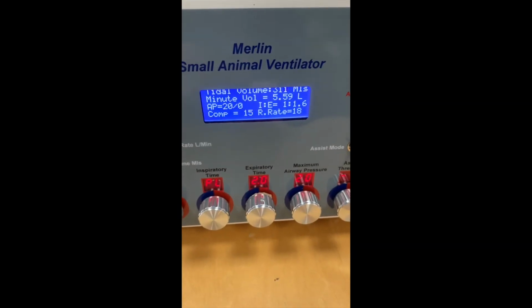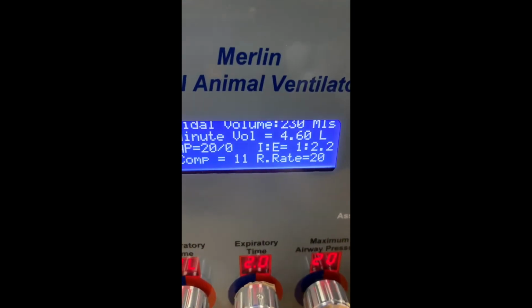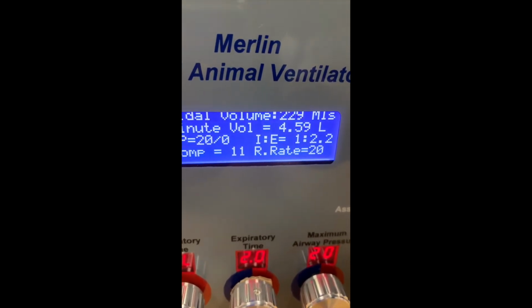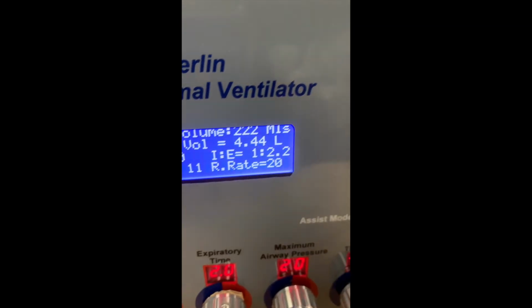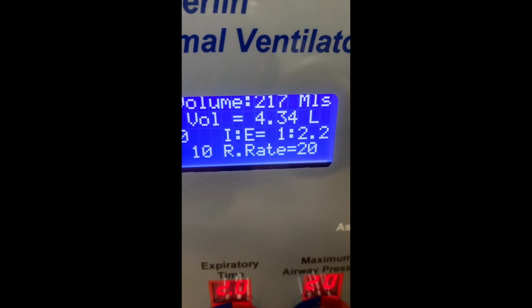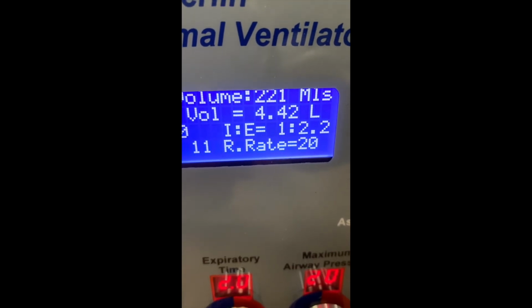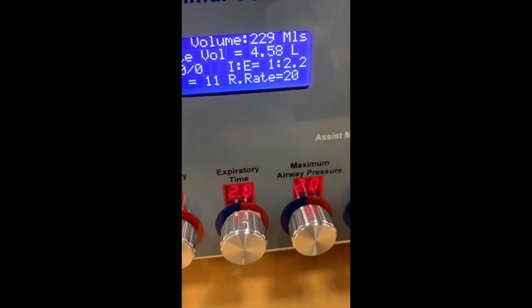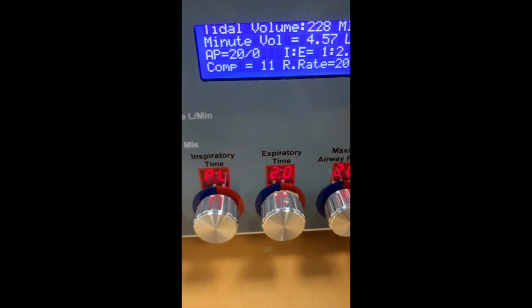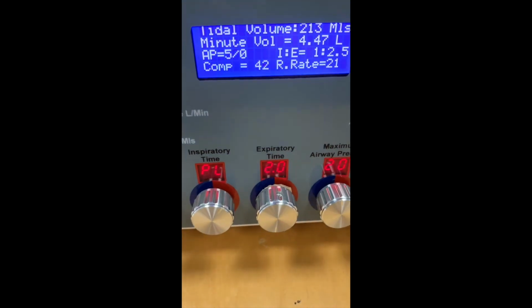So in this instance, what happens if we restrict the patient's chest? So we'll do what we did before, restrict the patient's chest. Because we're pressure cycling, the airway pressure still doesn't go above 20 as our target pressure, but of course the delivered volume is now reduced because the pressure is reached much sooner. So now we're only delivering a tidal volume of 213 mils. As a consequence, our minute volume is reduced and our inspiratory expiratory ratio has gone to 1 to 2.2. And our compliance has also dropped because we have a less elastic lung. We would remove the restriction and go back to the situation we were in before.